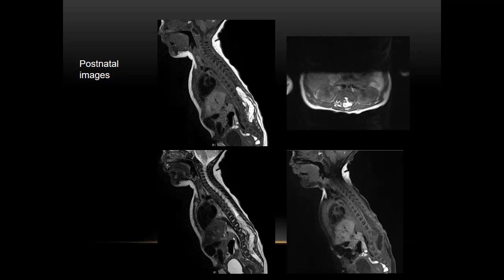So I'm going to stop over here. I think fetal MRI is really helpful, but there are safety considerations that you need to look at, and we've discussed some of those. And if you use contrast, I would recommend not using contrast in early gestational ages, only in later gestational ages. Thank you very much.